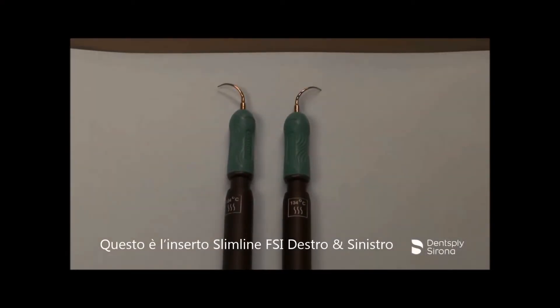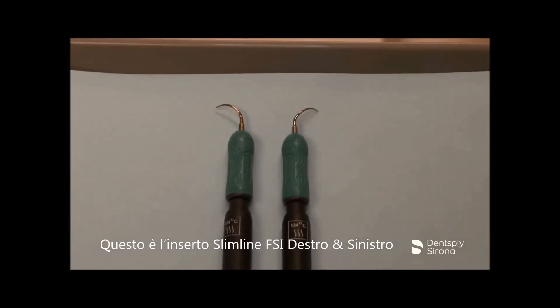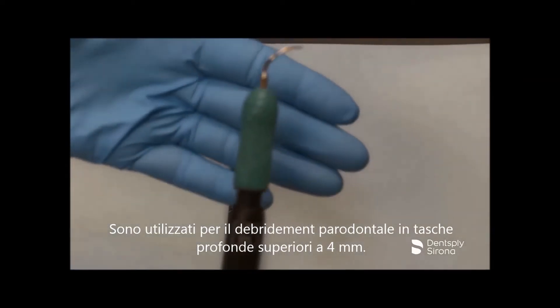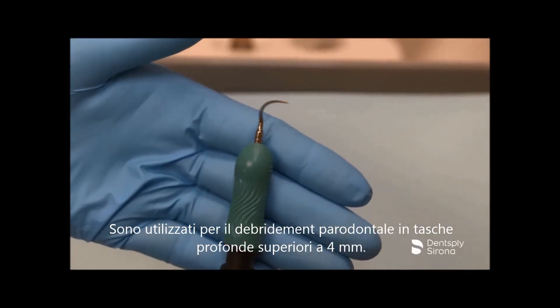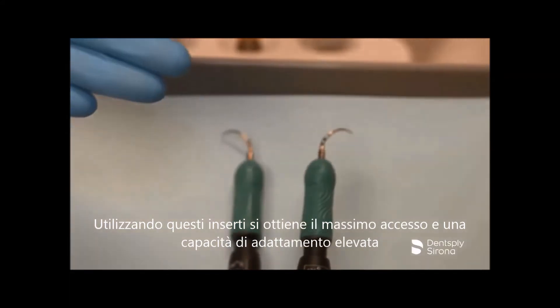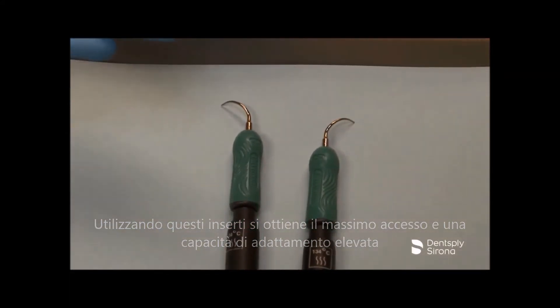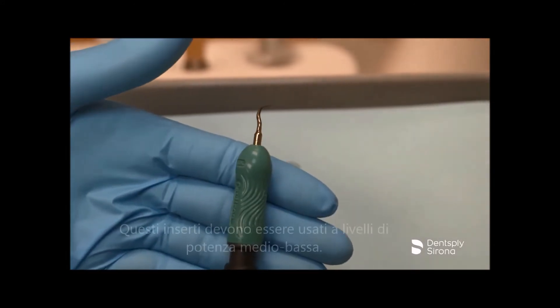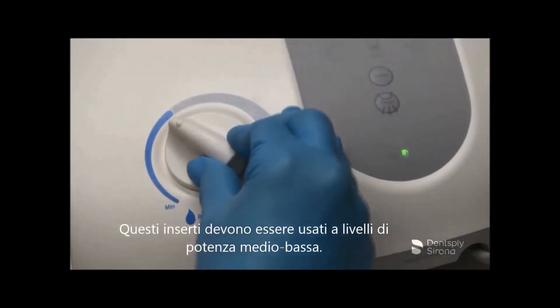This is the Cavitron FSI Slimline right and left curve. They are used for fine periodontal debridement in deep pockets greater than 4 millimeters. Utilizing these inserts provides maximum access and adaptability to root anatomy, including concavities and furcations. These inserts should be used at low to medium power levels.